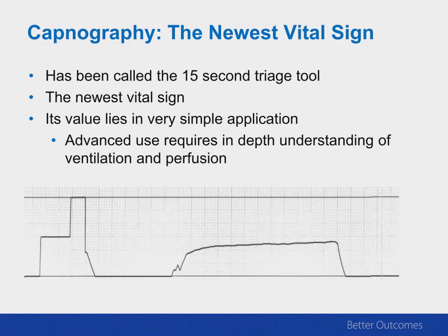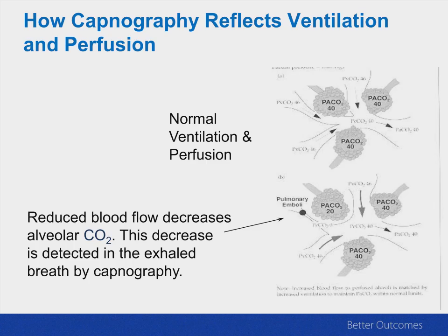So when we start this presentation, like I said, this really could be considered the newest vital sign. And if you really had to have one more than heart rate, respiratory rate, blood pressure, I would choose the capnogram. And the reason for that is very simple. It assesses both the person's breathing and their blood flow, their cardiac output.